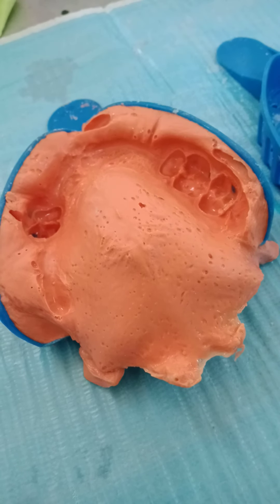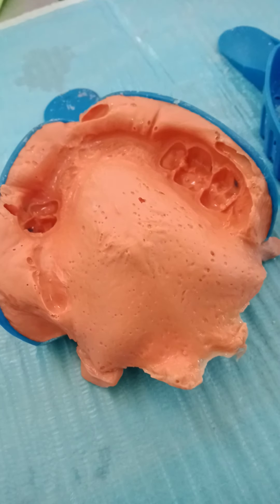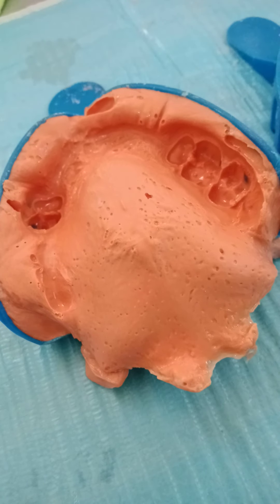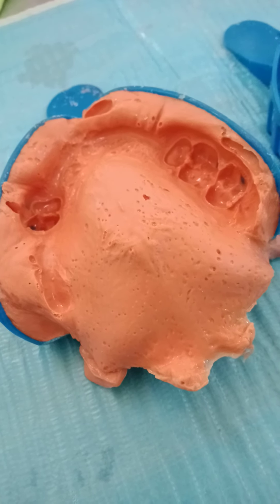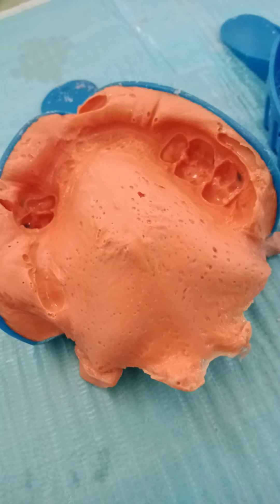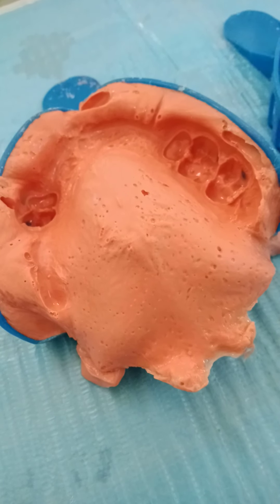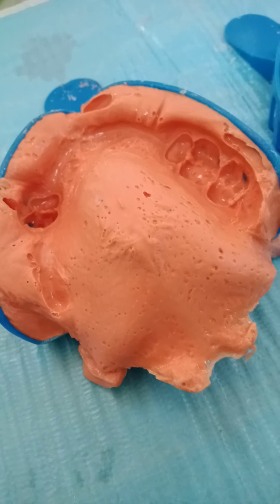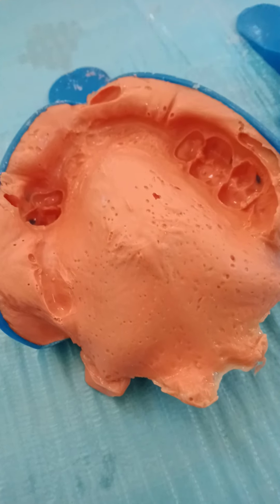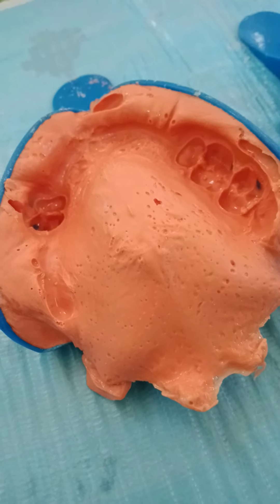The technician didn't have enough time and the patient is in a hurry, so we don't have time to do a special tray in the next visit. The patient is in a hurry, so we're going to do a secondary impression here in that area. First of all, why do we need a secondary impression?